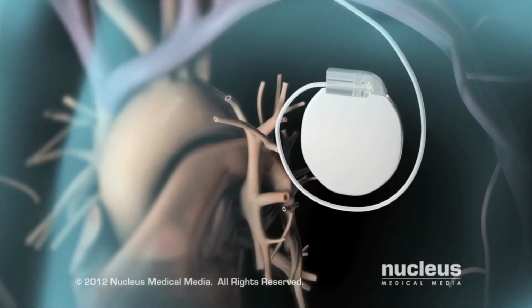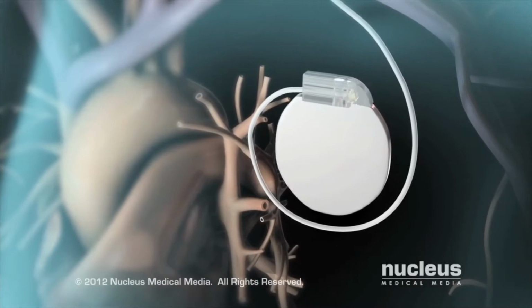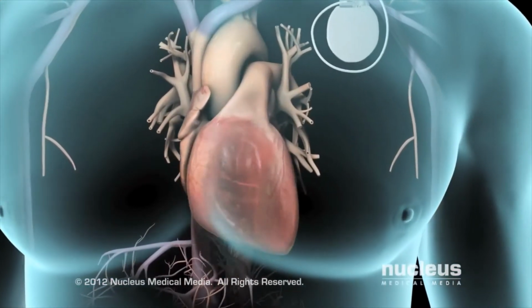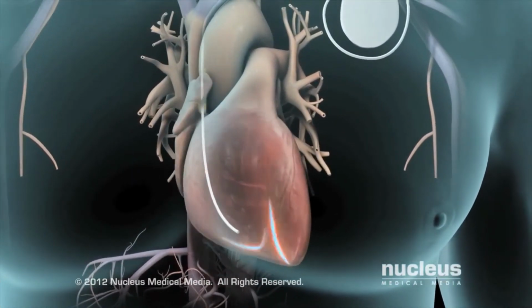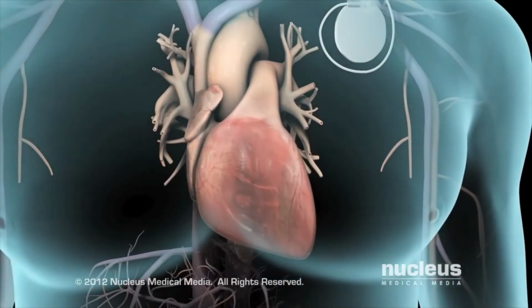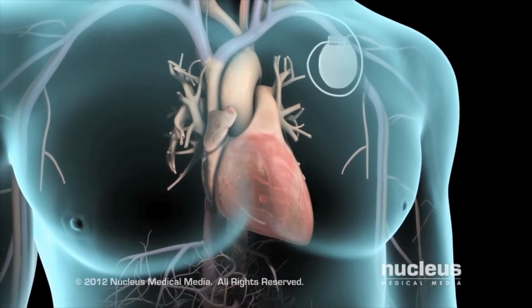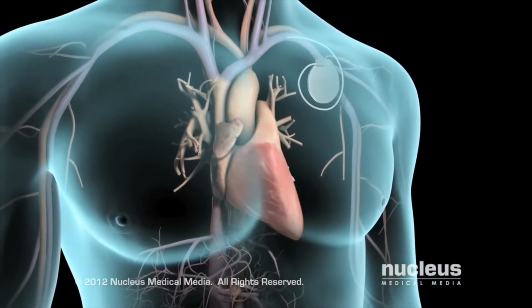The battery-powered ICD constantly monitors your heartbeat using a computer. If a life-threatening arrhythmia occurs, the ICD delivers an electrical shock to your heart, resetting your heartbeat back to normal. The ICD can also be programmed to pace the heart and restore its natural rhythm.